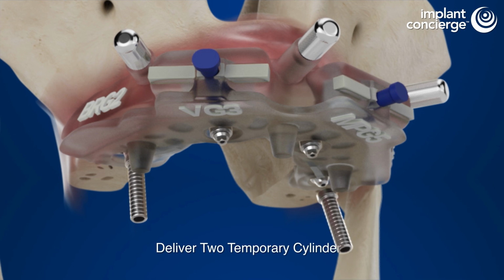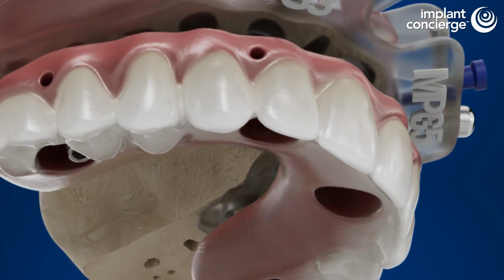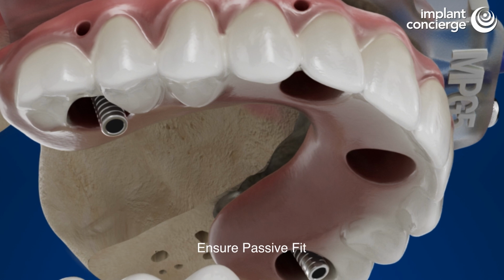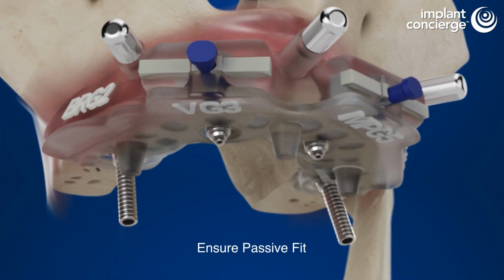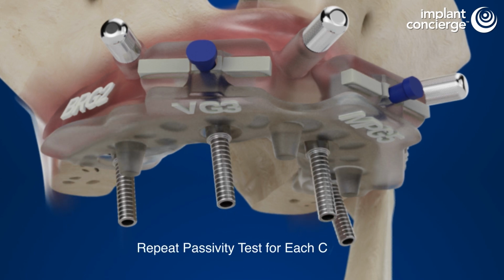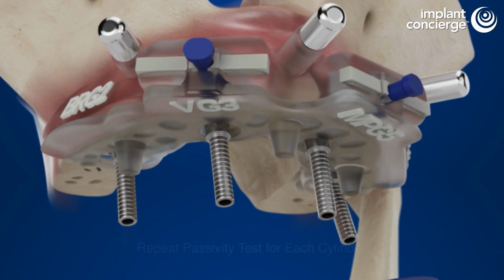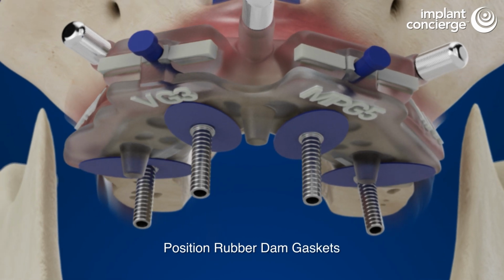Place 2 temporary cylinders bilaterally, hand tightening each. Ensure a passive draw of the passive fit bridge by trying it in and adjusting it as needed. Repeat these steps for each temporary cylinder. Position rubber dam gaskets over each cylinder, avoiding interference with the multi-purpose guide indexes.